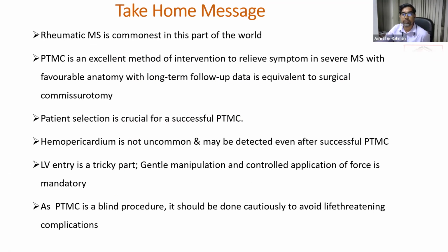PTMC is an excellent method of intervention to relieve symptoms in severe MS with favorable anatomy, with long-term follow-up data equivalent to surgical commissurotomy. Patient selection is crucial for a successful PTMC. Hemopericardium is not uncommon and may be detected even after successful PTMC.